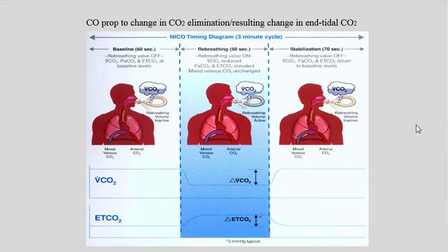The diagrams make the procedure a little bit easier to follow. Words are always cumbersome, but diagrams make it so much clearer. The patient is connected to his endotracheal tube and he breathes normally for at least 1 minute. And you can see we established the baseline values for VCO2, CO2 elimination as opposed to oxygen consumption, and end-tidal carbon dioxide.